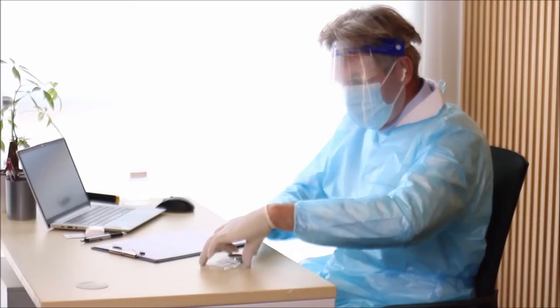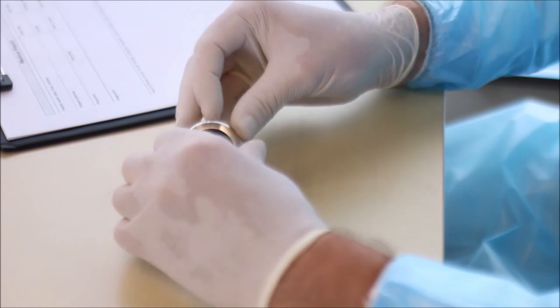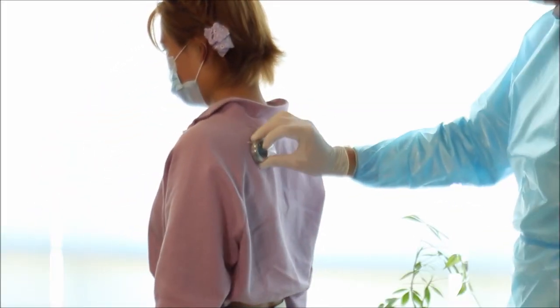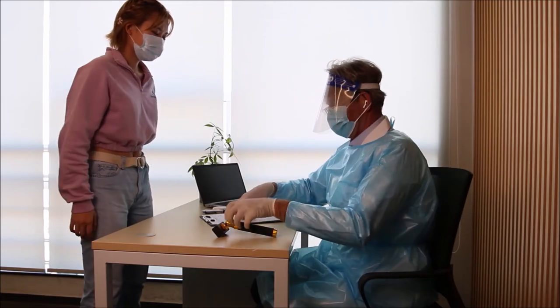Stemo Pro protects you and your patients in several ways. You may use a one-time plastic bag to hold the Stemo Pro and dispose the bag after use.